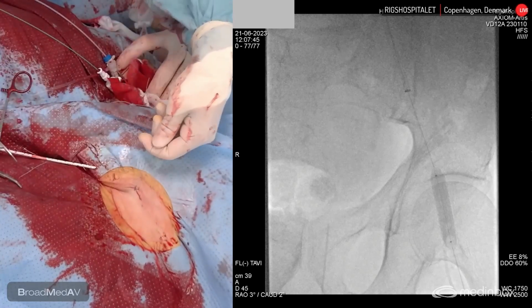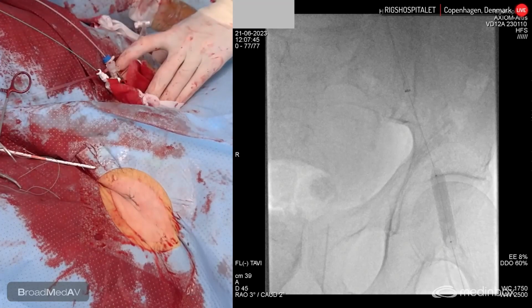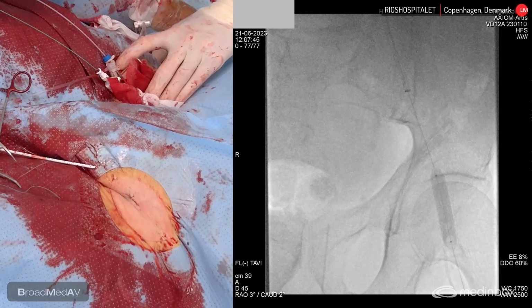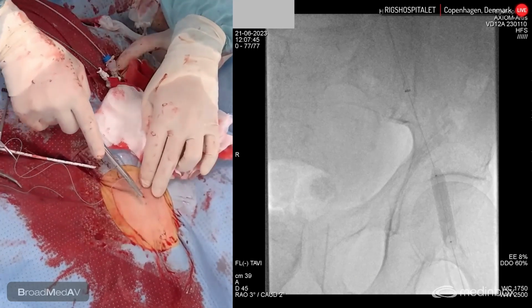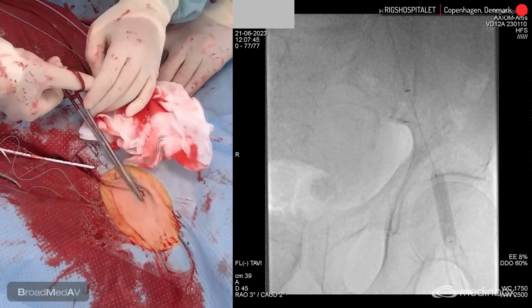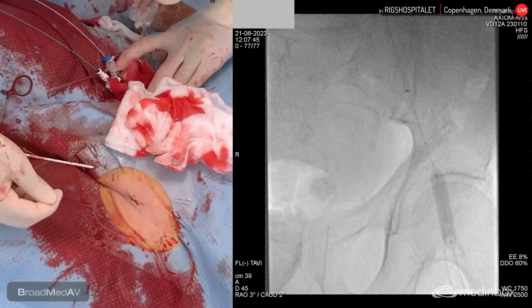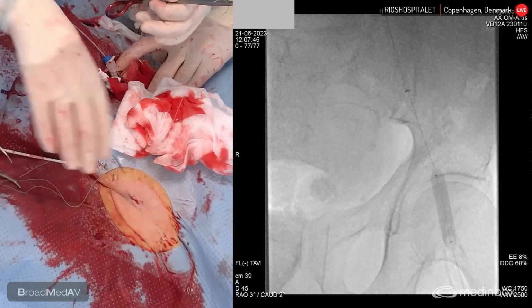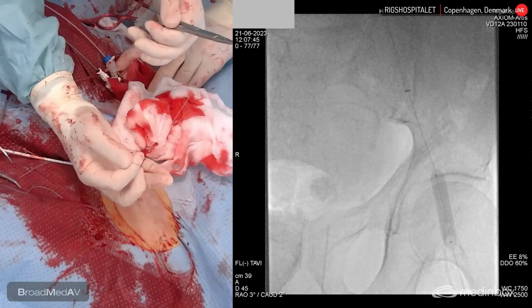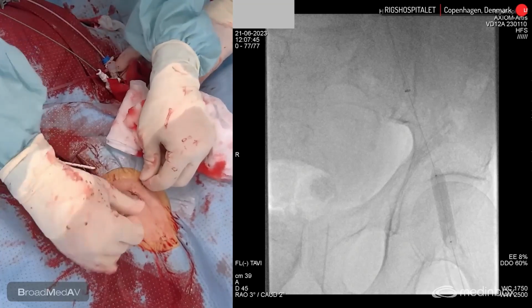Yeah. So I think it was an interesting case to see, to be honest. I mean, horizontal, calcified, with Acurate. We had the issue, despite good predilatation, of the extreme underexpansion, but then the way to do it in a safe way. And then, vascular, there was a lot of calcification. We didn't let it come to a complication, but we took a lot of preventive steps to prevent it. So I think that's what we show today.